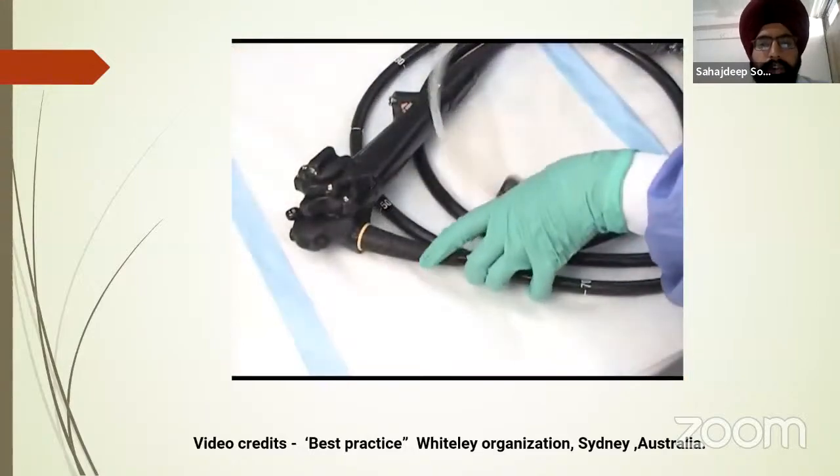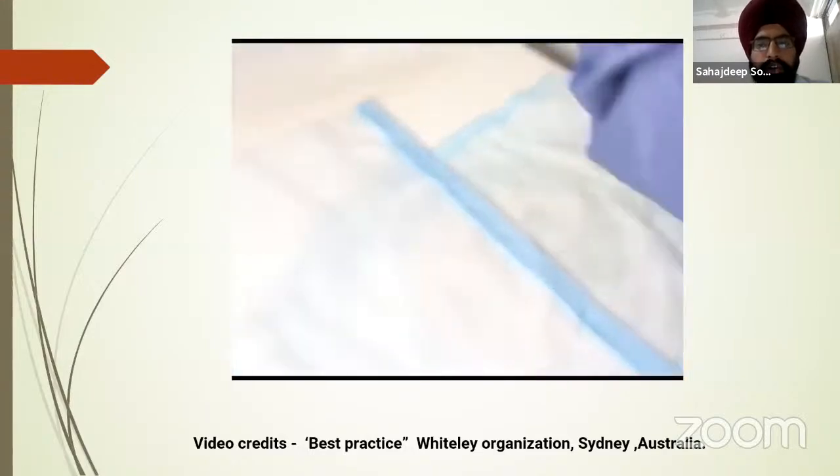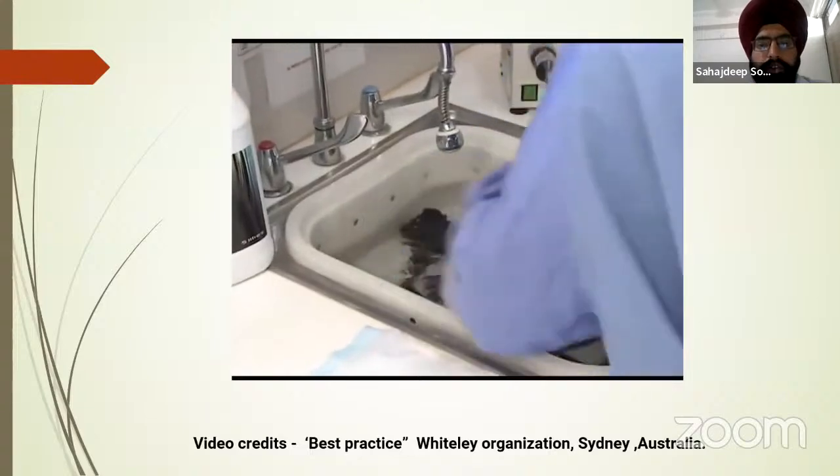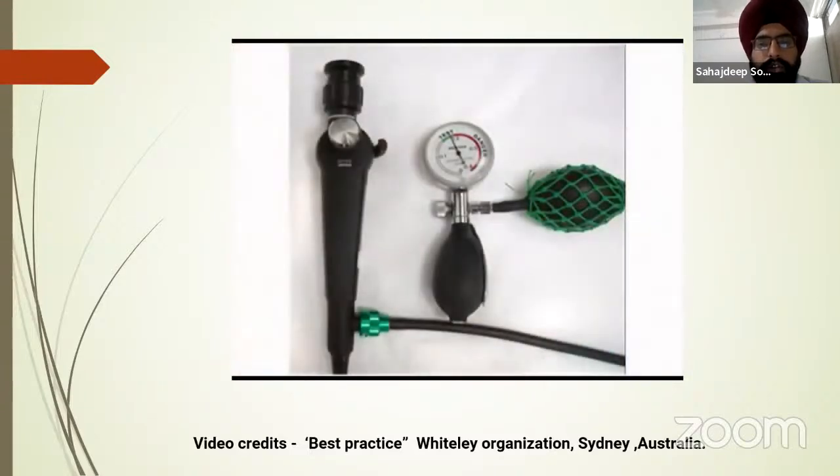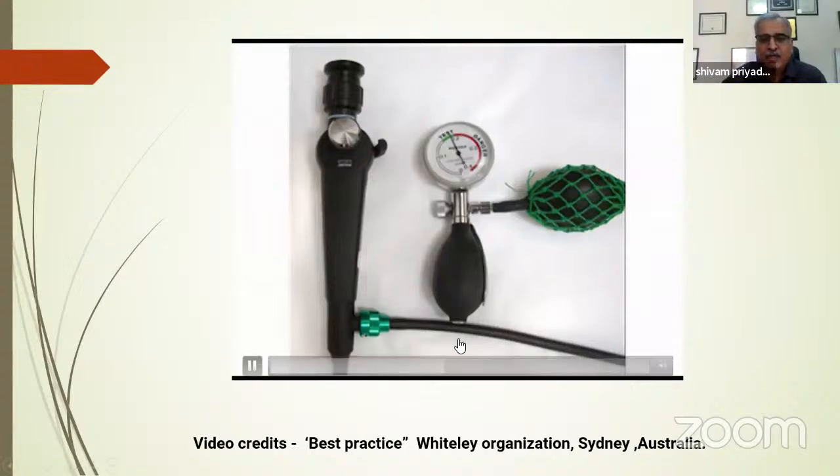After connecting, then here the pressure gauge has been attached first. Yes, Sahasdeep, we have already seen it. Just a little forward. Yes, sir.